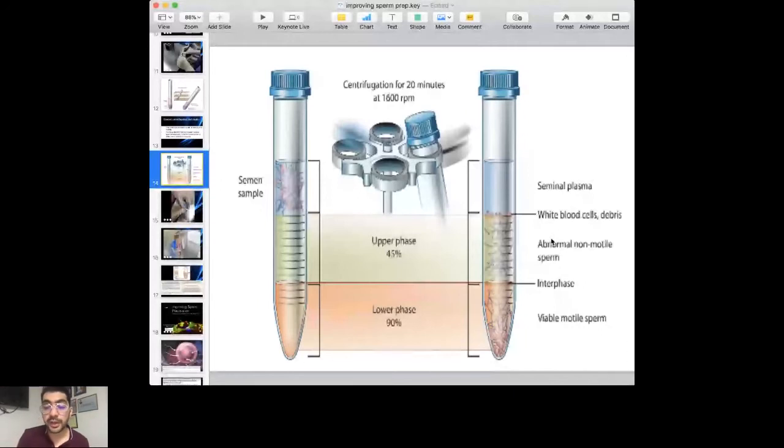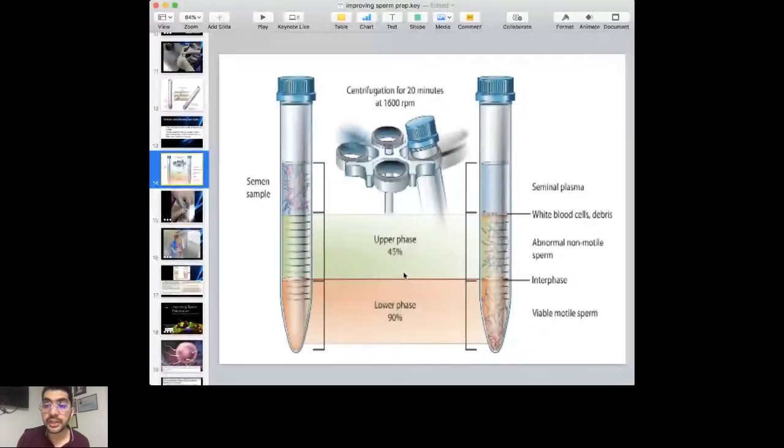Now, what is the preferable method? Shweta, I'm going to come to your question. What is the preferable method for IVF insemination? Now, like I mentioned earlier, if I have a very clean sample, if there are no round cells or pus cells in the sample and the motility is great, I would prefer using swim up even for IVF insemination.